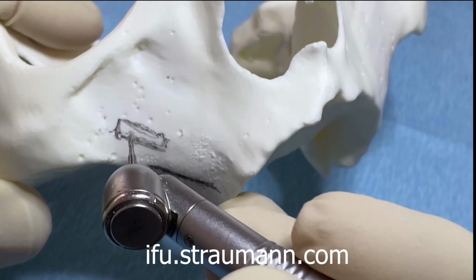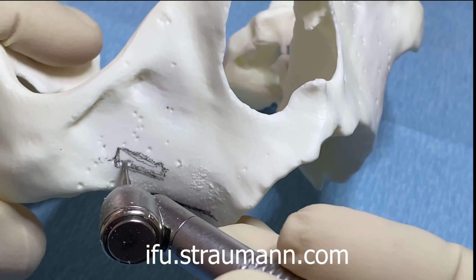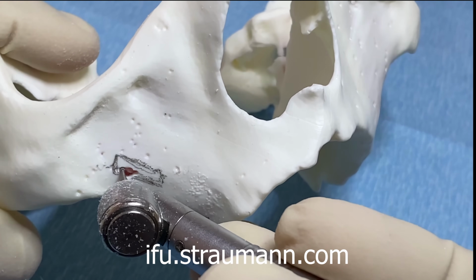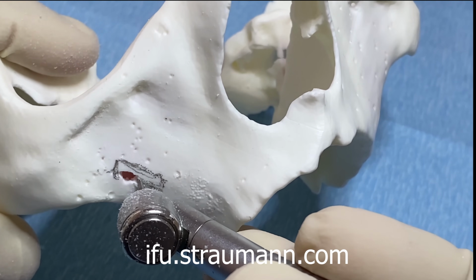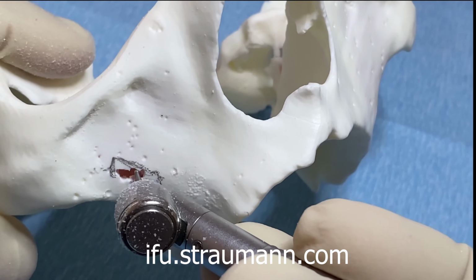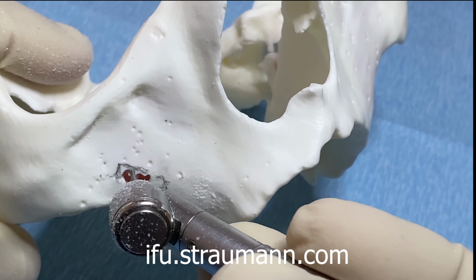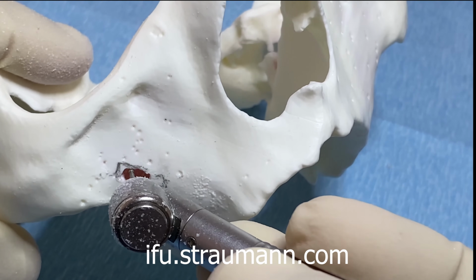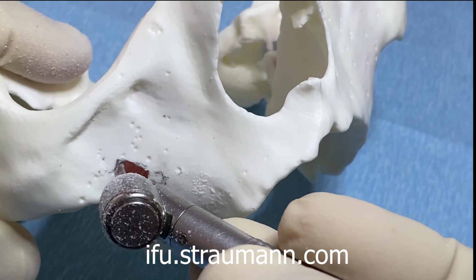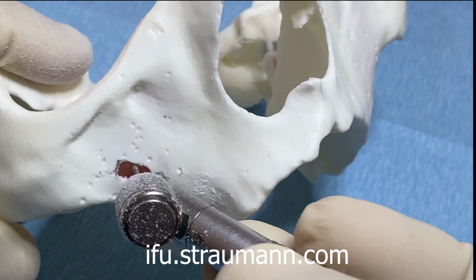So we use some kind of a small burr, and as you can see, we make an opening into the sinus, and you can do it a little bit at a time, or you can just go ahead and make your little run like this, trying to keep the opening parallel and a couple of millimeters wide, as you can see. Now, if you can maintain the Schneiderian membrane, that's fine. But if you cannot maintain the Schneiderian membrane intact, that's also fine too, because it's not absolutely necessary to keep the Schneiderian intact.